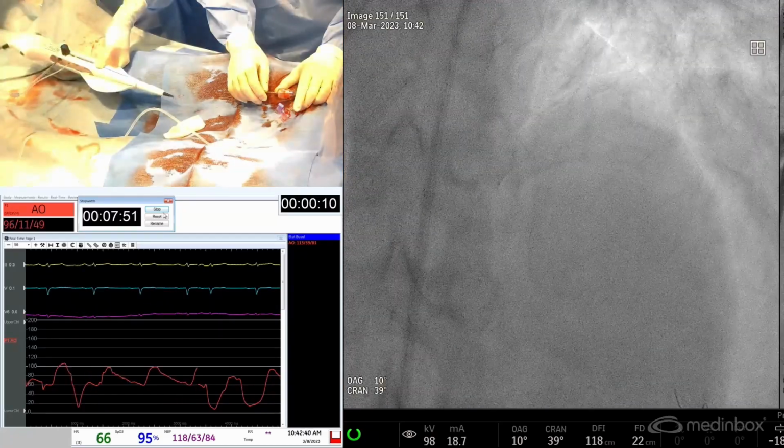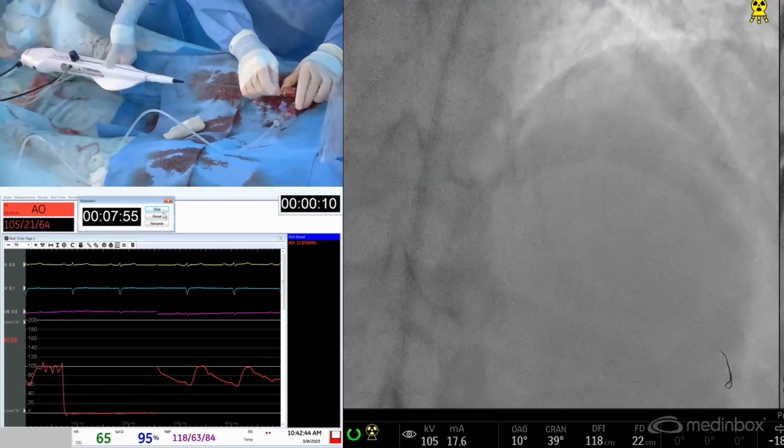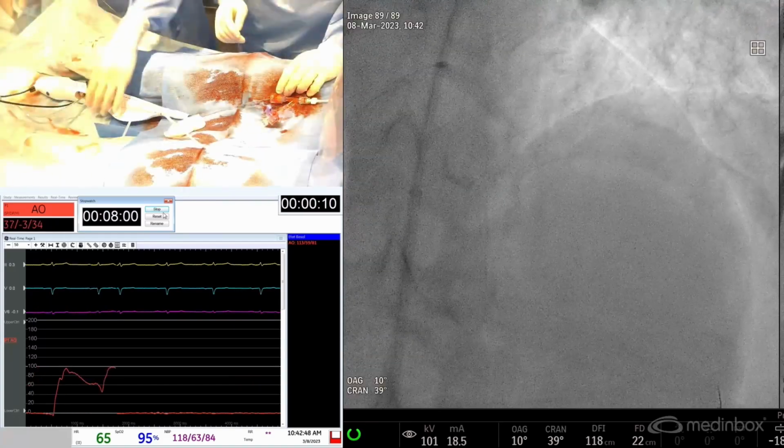Stop. Un peu. On est pris. Pull back on the wire. Yep. Give me a second. Pulling back. Sorry. Back. Yep. There you go. All right.